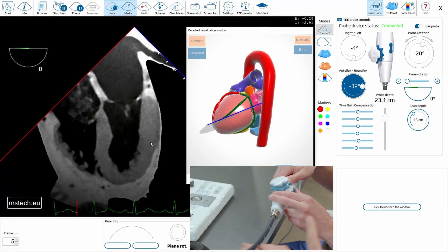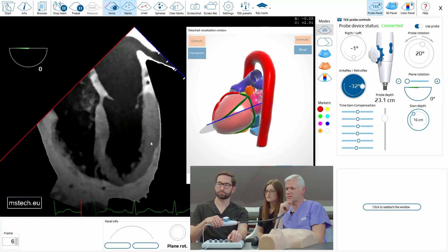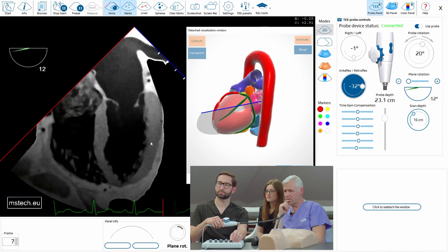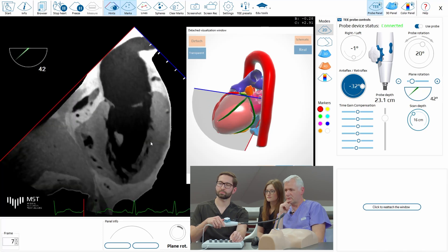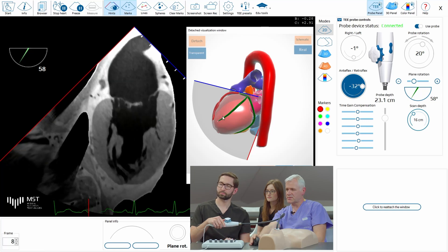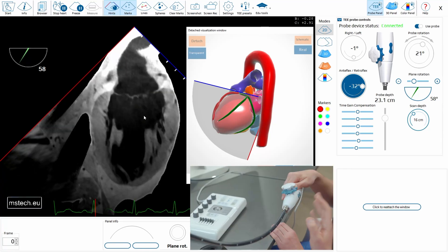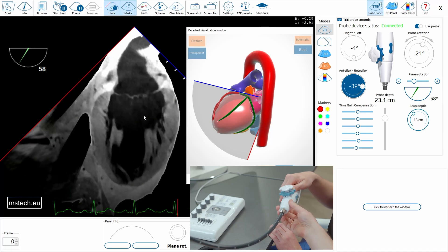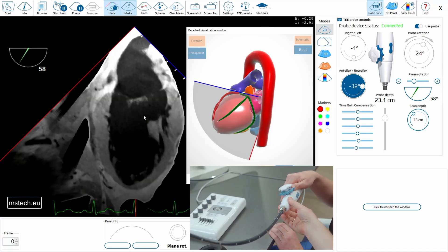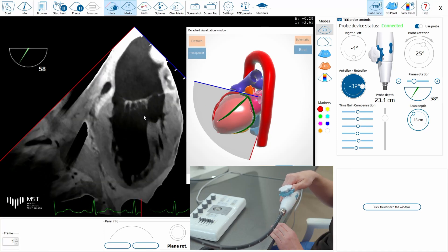Now we'll move to the intercommissural view. Keeping the probe as it is, just rotate the plane to 60 degrees. Here you see the papillary muscles, which indicate that you are probably in the right plane for the intercommissural view. You can now slightly rotate left or right to see the valve really well — you are probably correct here.